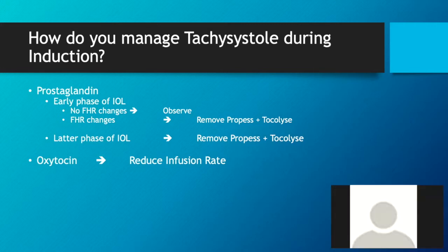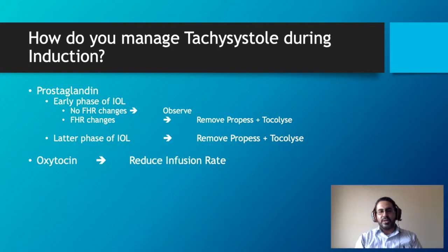Even if the baby is not showing any responses as yet, if we keep the lady contracting at 6 in 10, for instance, and we're using up the baby's reserves, we are going to run into problems. The idea is to take this slowly to keep this baby happy.